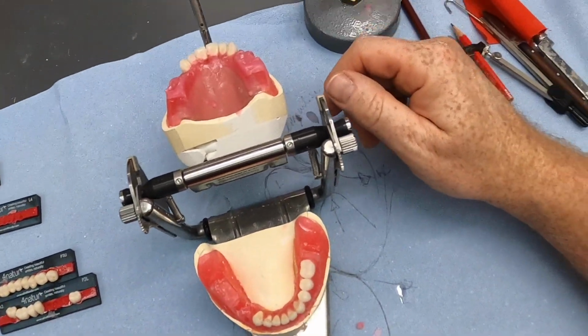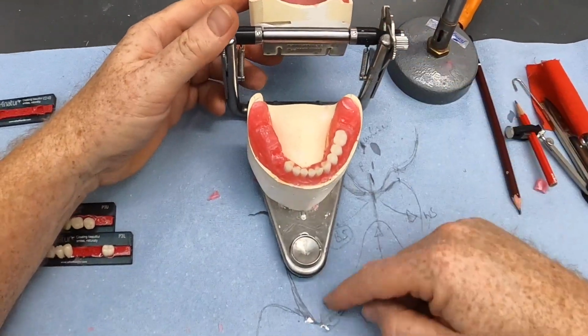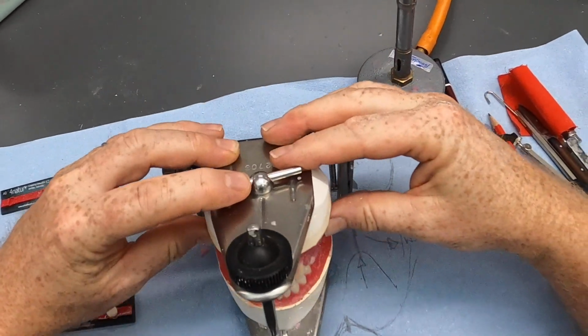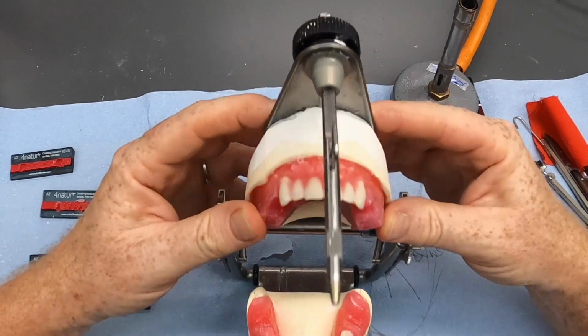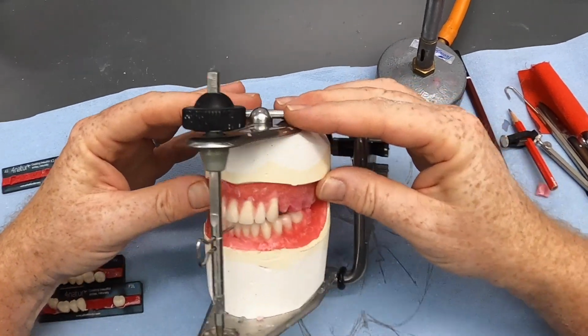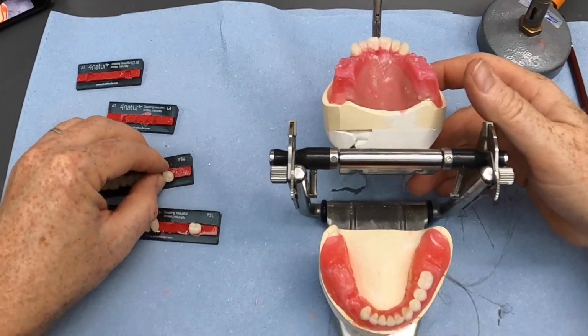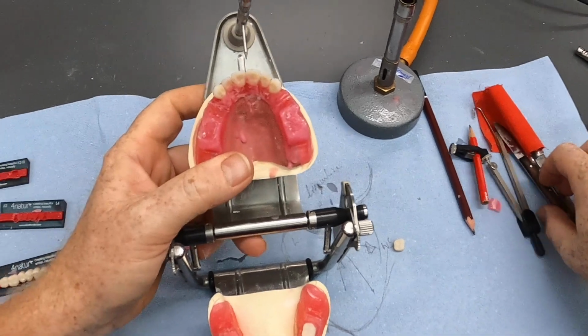We'll come to that later. We'll set these up with conventional, if you like, occlusion here. A conventional tooth arrangement for simplicity for today. So now we've got the lower tooth positioned, we want to take our upper 6 and see if we can get that to occlude nicely.